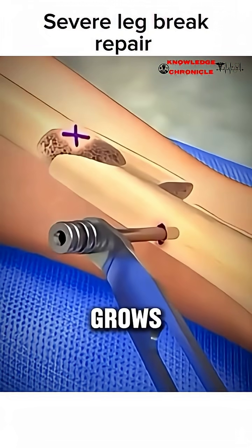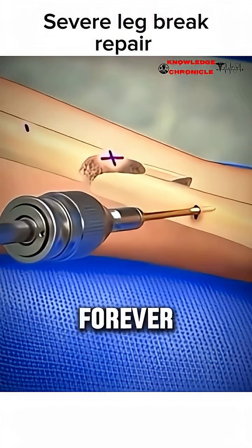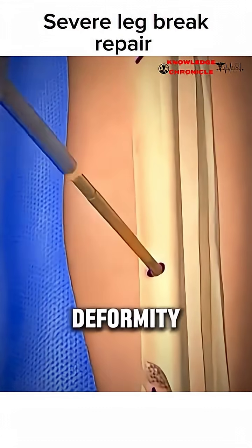Over time, your own bone grows around the hardware, and in many cases, the screws or plates can stay in forever without causing problems. It's like giving your bone an internal scaffolding so you can walk again sooner and with less risk of deformity.